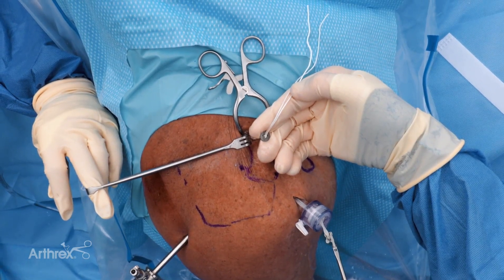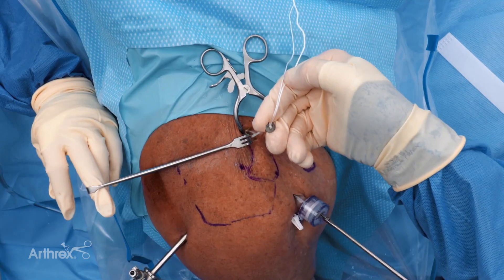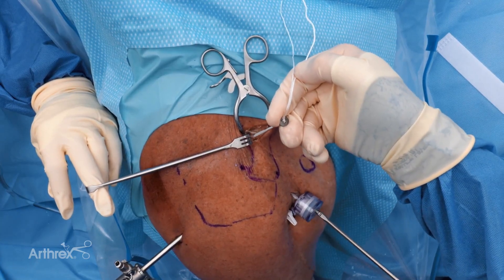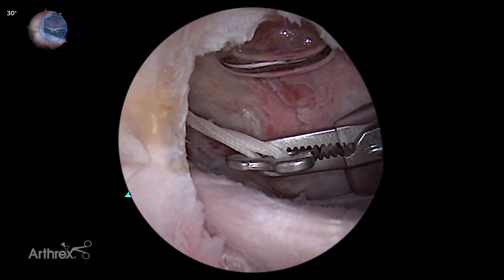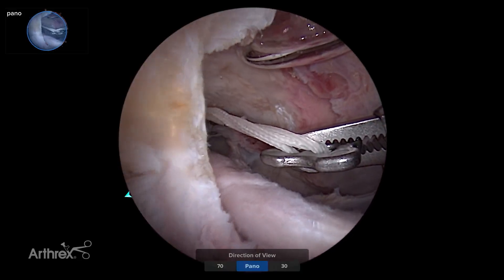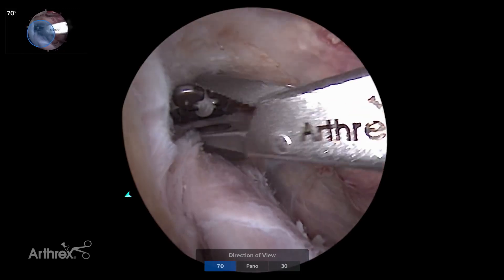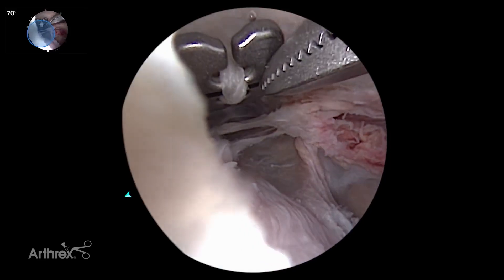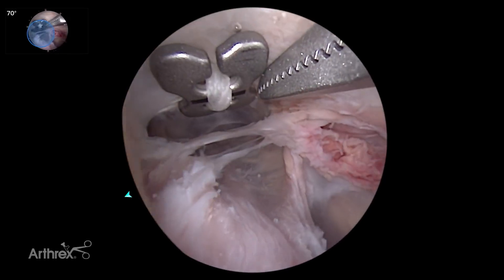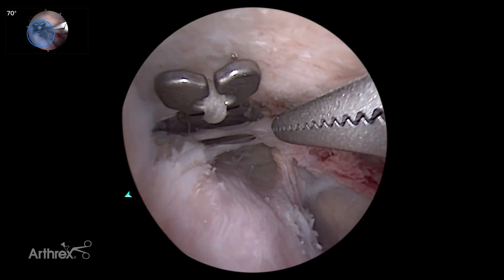He's going to give me a little bit of retrograde tension as I walk the button into the shoulder. As I turn to look under the coracoid, I'm going to scroll again through the Panascope at 70-degree and get a really good look — not just at the suture going up, but also at the laser line orientation along the long axis of the coracoid — so I know my button's in the right position and sitting firmly against the bone. That's exactly where I want to be.